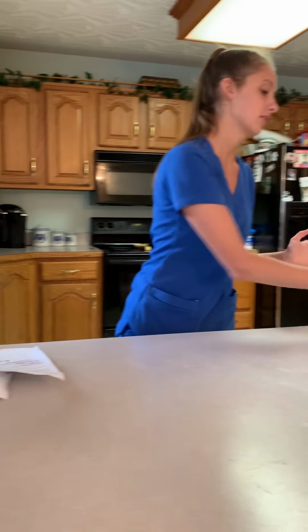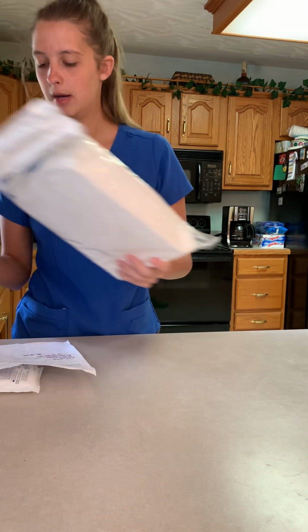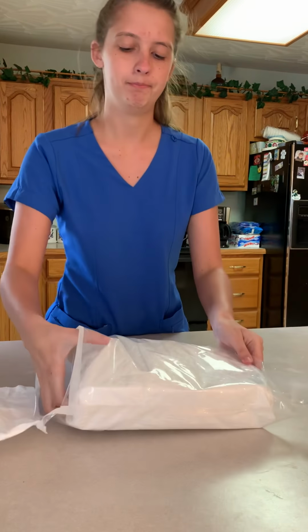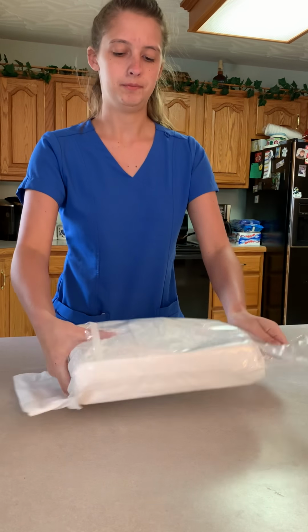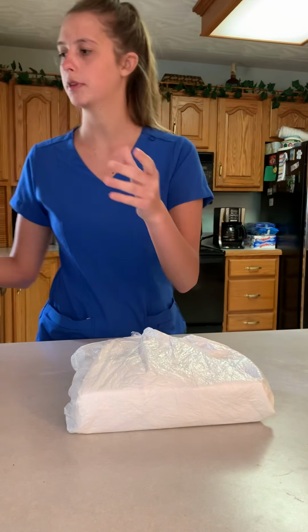Okay, so now I'm going to remove my gloves. I'm going to wash my hands. Okay, next we're going to go ahead and open up our sterile catheter kit tray. I will designate this as my garbage and put this at the foot of my bed.